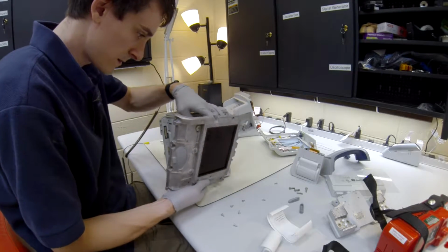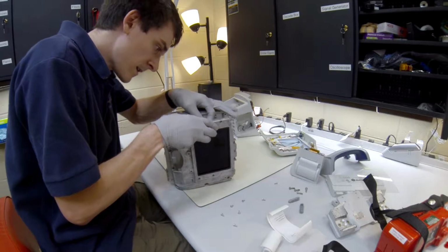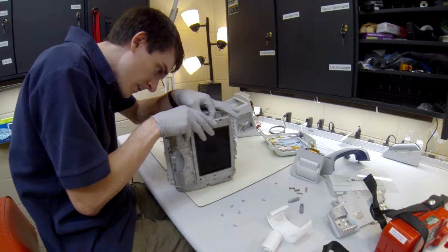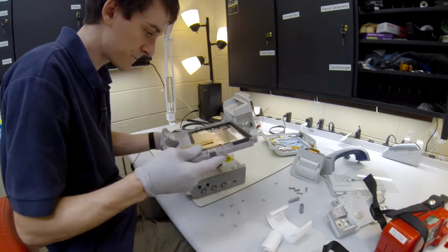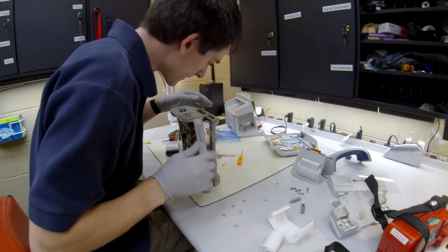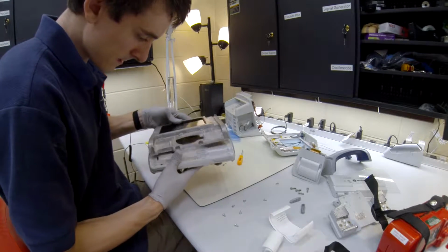Alright. So the black connector goes on the right side, and I won't say white because technically it's gray, I guess. I'm colorblind, so it looks white to me. One's black and one's white. That's all that matters to me right now. Okay. Alright, so I got all those pieces back in, both ribbon, or both cables, sorry.